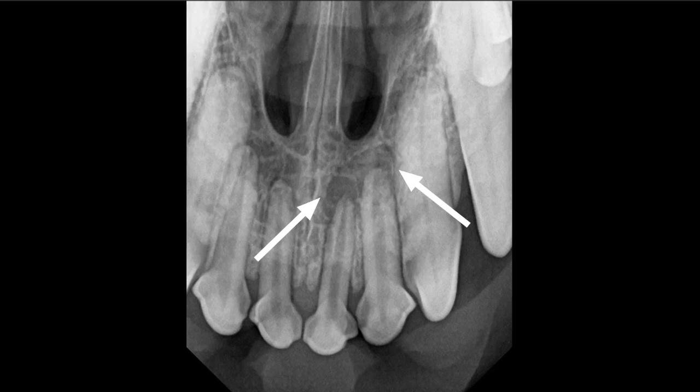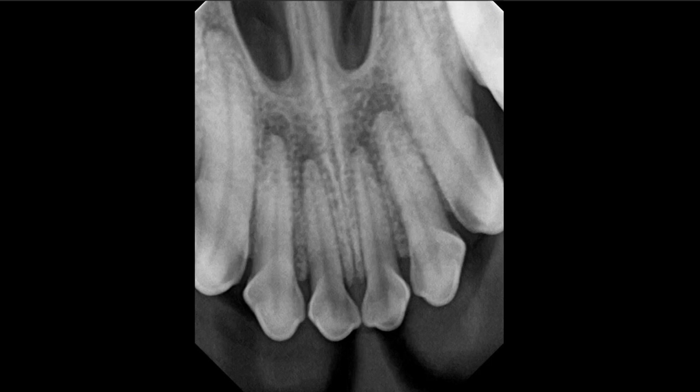The lucency, again, same pathophysiology, tooth dies, necrotic pulp causes inflammation and subsequent bone destruction. So again, those are extractions. They could have root canals done on them. We don't recommend that in general for incisors, but that might be an option. I would never personally recommend root canals on those with that much bone loss. My thought is I want to get that inflammation and bone change gone now, not in a couple weeks when that bone heals. So I'm going to recommend extraction on those every time.